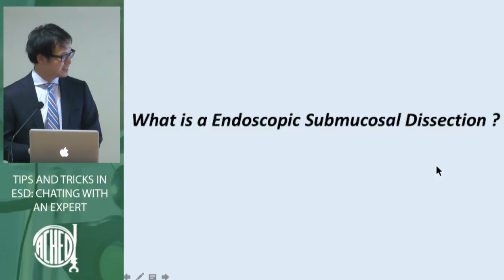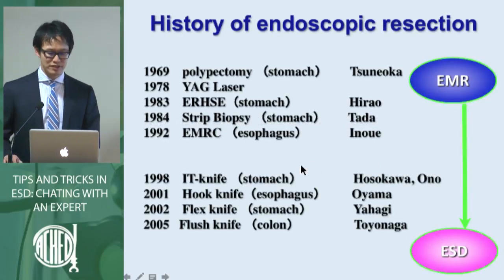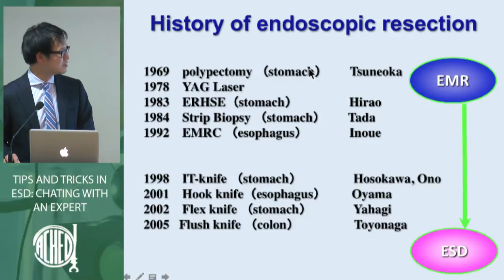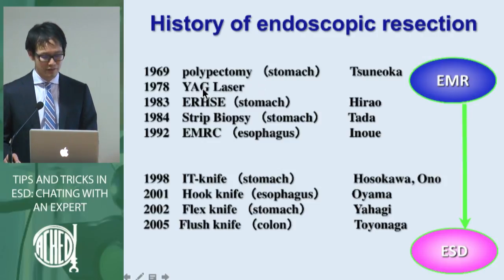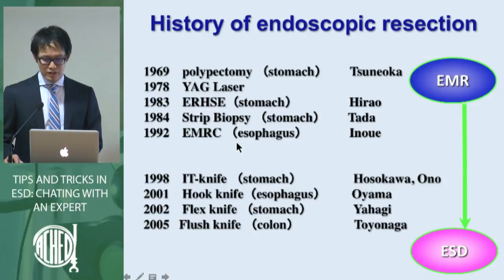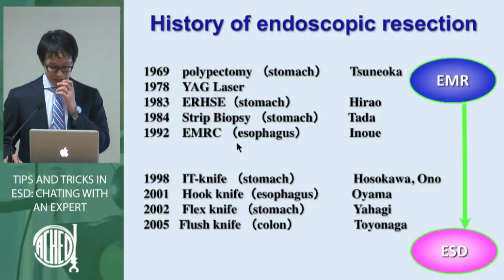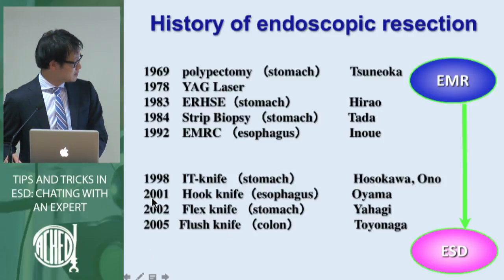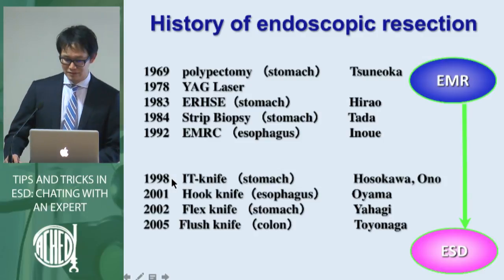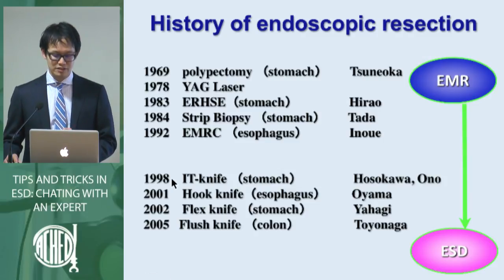So this is what endoscopic submucosal dissection is. I will show the history of endoscopic resection. The history starts from polypectomies and laser dissections, a lot of procedures. EMR was developed and became widespread at the end of the 1990s. ESD was first developed in 1998, because we wanted to remove large superficial lesions endoscopically.